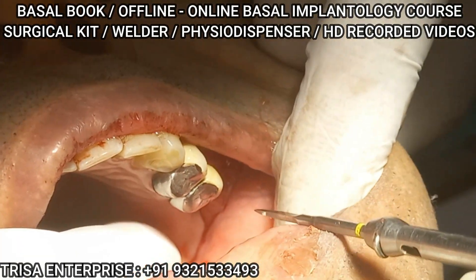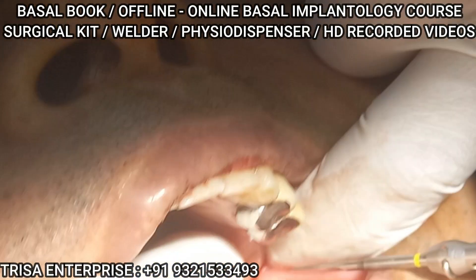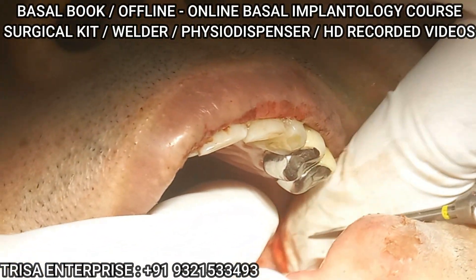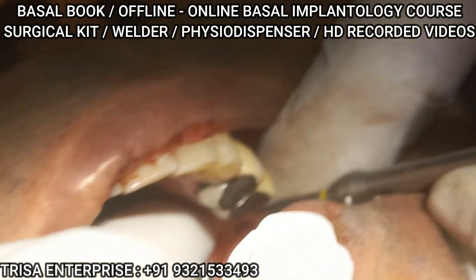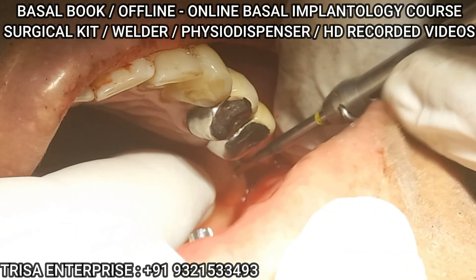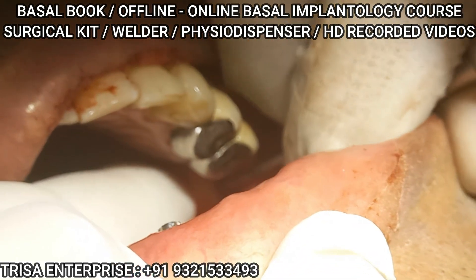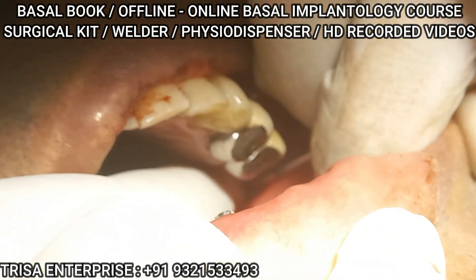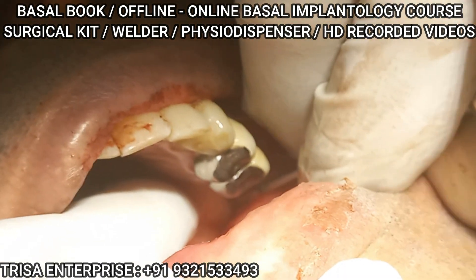I will start roughly around this. Now I am getting — Usam, just peel this. You are getting good resistance. Now this is the direction — over here.